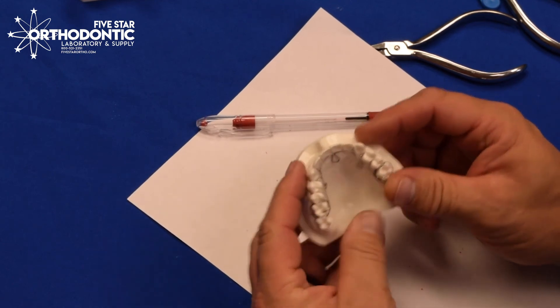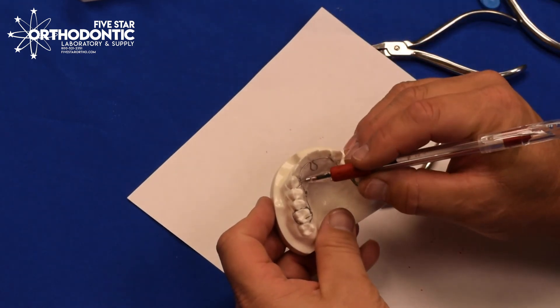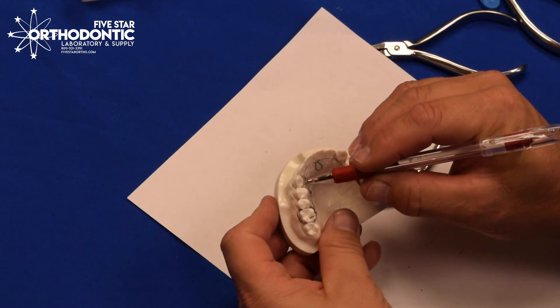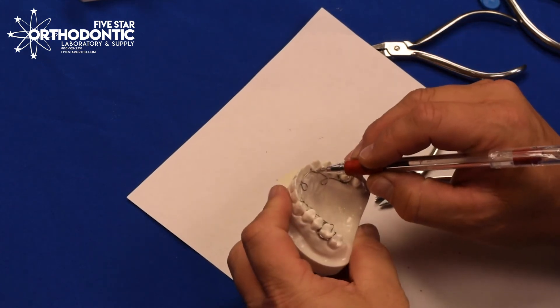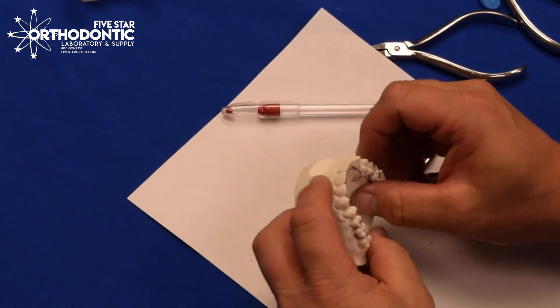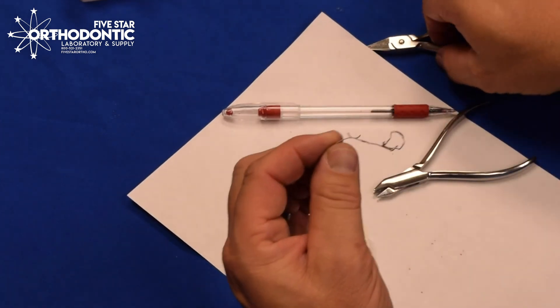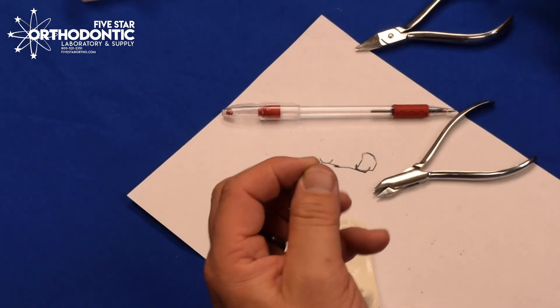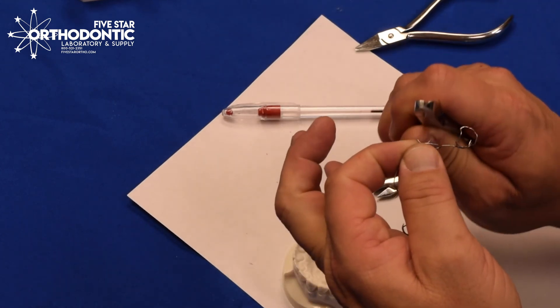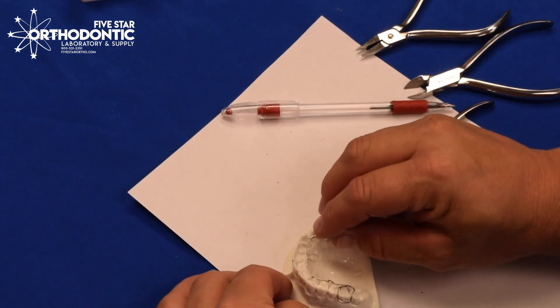A key point: there's going to be a lot of pressure in the cuspid area. It's a good idea, before you seat the appliance, to put a little dot of composite just about two millimeters above the CEJ or cervical junction — that will help keep the appliance seated. Also, if the C-clasps are too long, you can come in with a cutter and relieve just by snipping the edges of the C-clasp, and then it'll make it a little easier to get the cribbing crescent onto the cuspid.